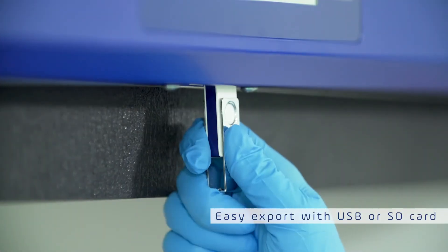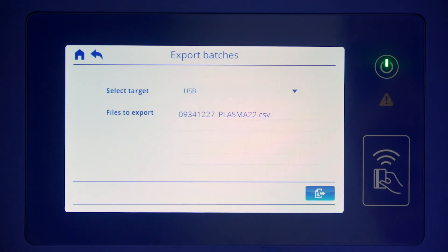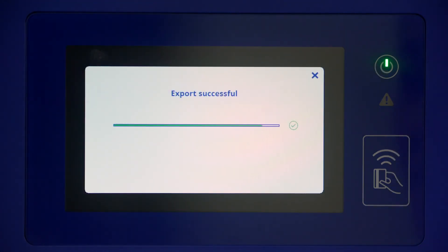For your records, you can export all data manually or generate reports on your computer, tablet, or cell phone via the B Medical Systems B Connected solution.